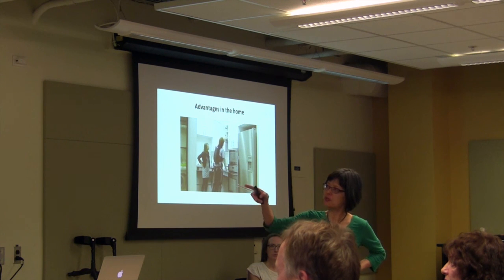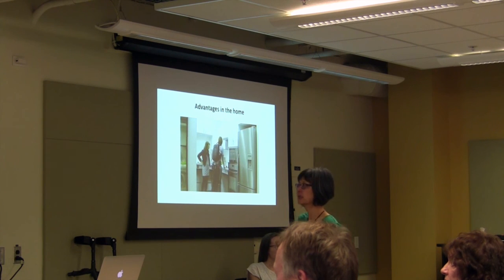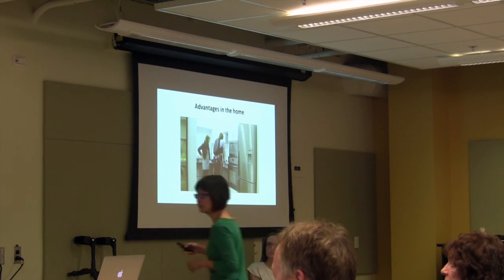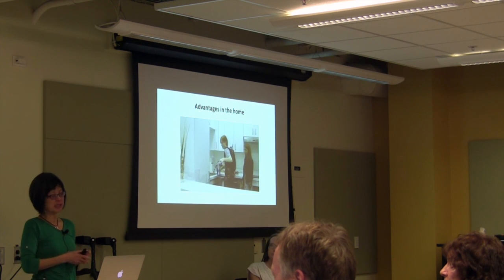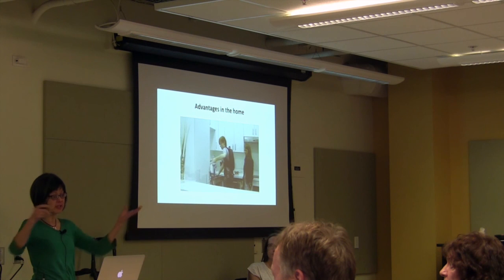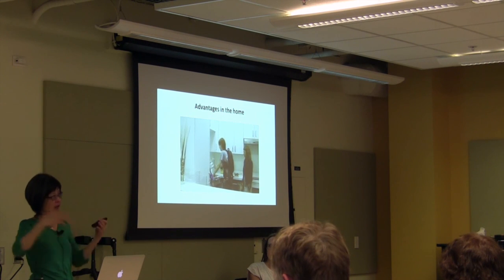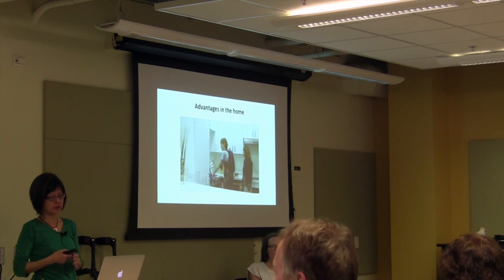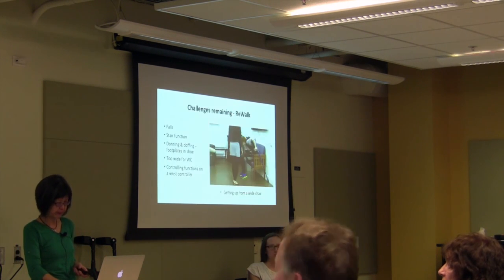And you can see she doesn't really have to lean on the cupboards too much. She's quite balanced in the device. And you'll see her going over to a sink to do dishes, and she tells us that she really loved this because washing dishes in a wheelchair is like having water dripping all the way down your arms and that sort of thing. So those kinds of things it seems to be good for.